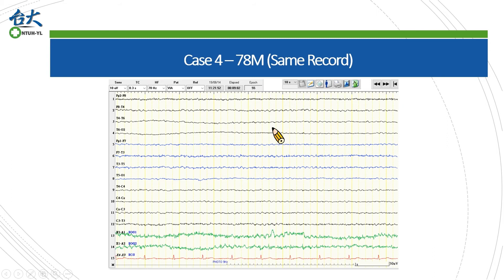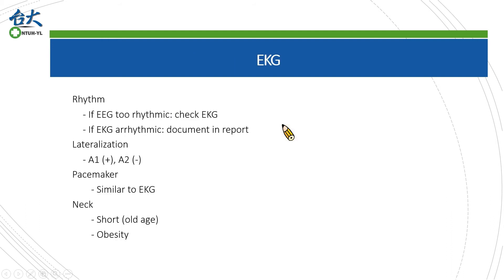This case is interesting because in the later data epochs the EKG artifact disappears. If you look more closely at the EKG trace, the morphology is also different. When we talk about EKG artifacts, we can identify them if they are too rhythmic. If we notice a rhythmic EKG artifact, it is better to document it in the notes to inform the primary physician.